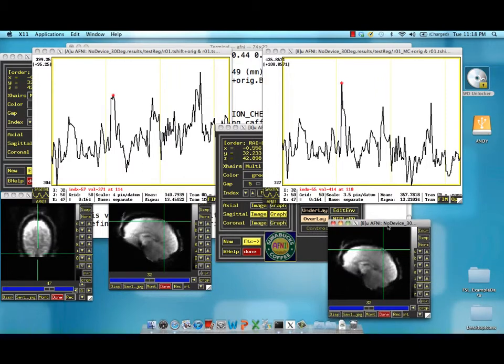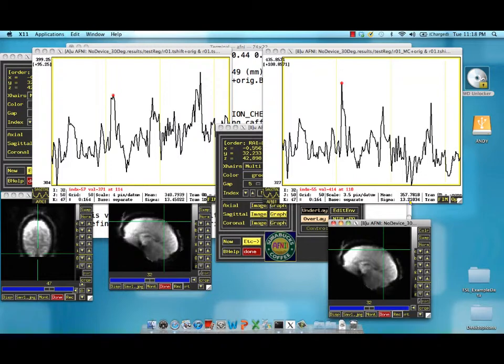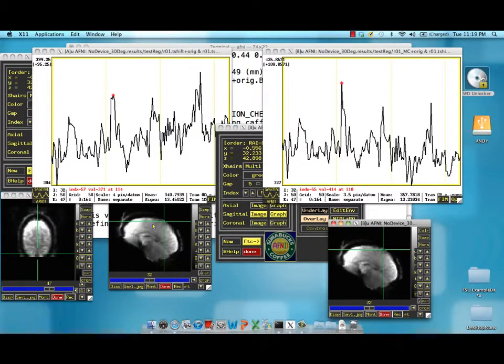Notice at this voxel, the pattern is roughly the same. There's a higher mean intensity image in the volume corrected one, and the variance is slightly lower in the signal. But the point is, there is a difference between this motion corrected volume and this non motion corrected volume, because there's been spatial interpolation introduced into the data set.